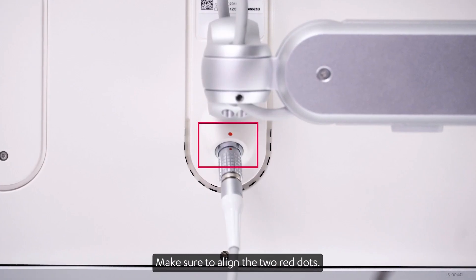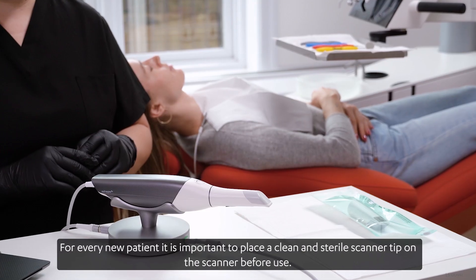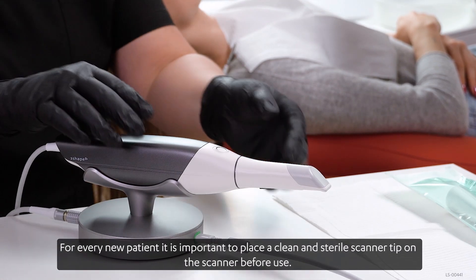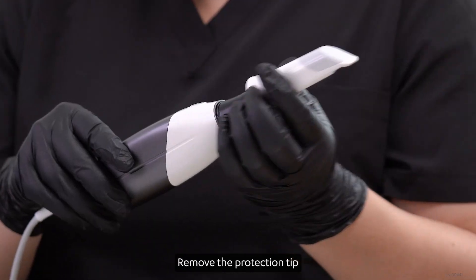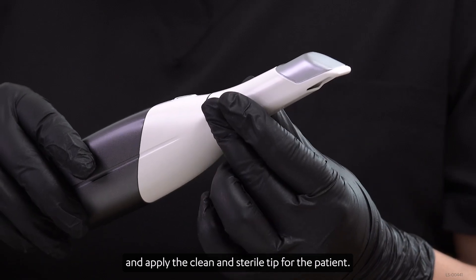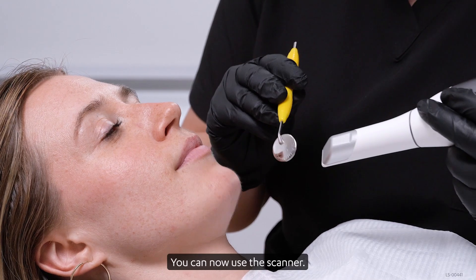Make sure to align the two red dots. For every new patient, it is important to place a clean and sterile scanner tip on the scanner before use. Remove the protection tip and apply the clean and sterile tip for the patient. You can now use the scanner.